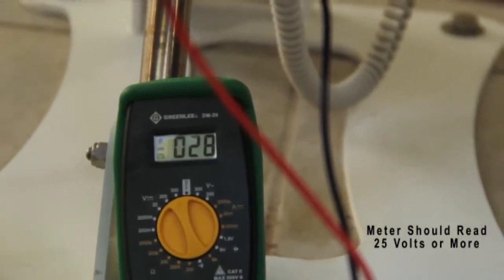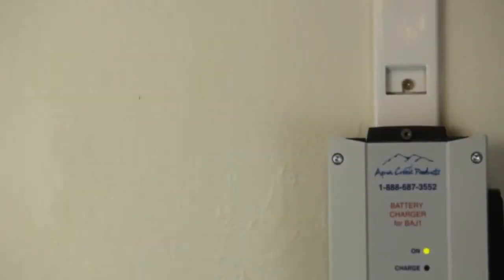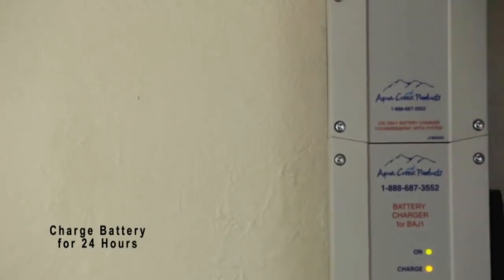If your battery voltage is less than 25 volts, place the battery on the charger and then check it again after 24 hours.